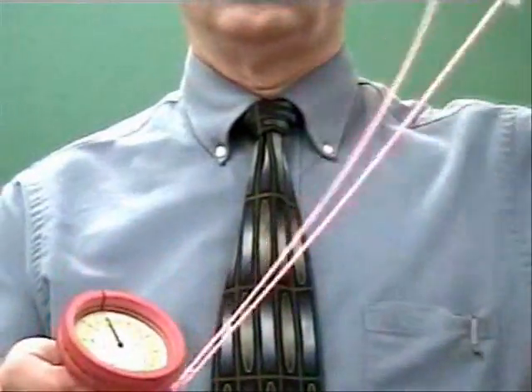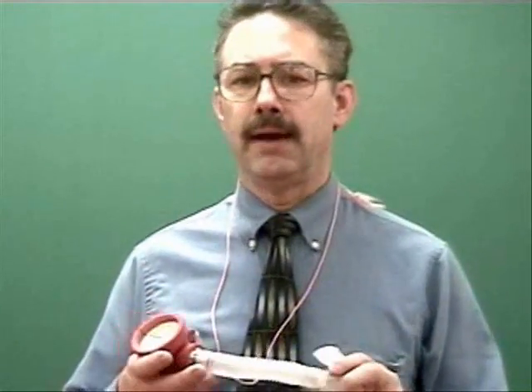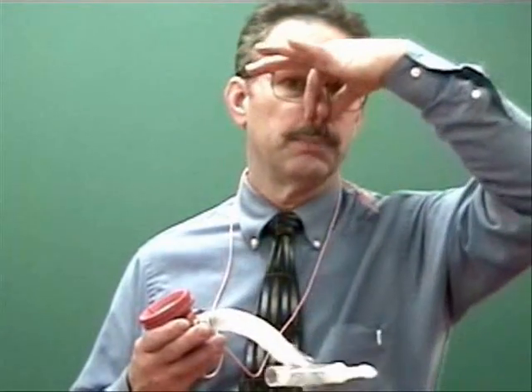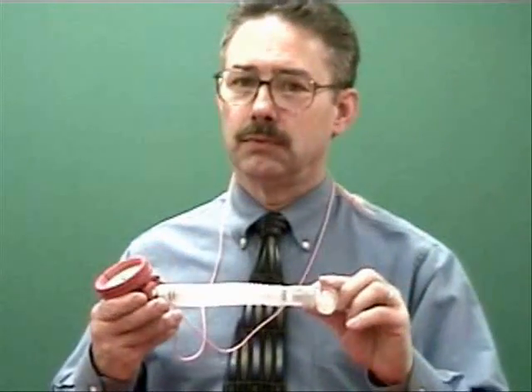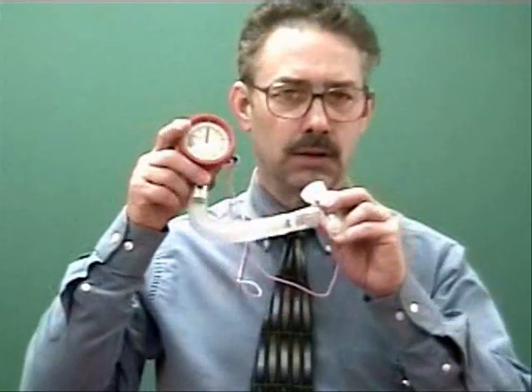So when we're doing a tidal volume and using a respirometer, you want to make sure you put the spirometer around your neck using the strap so that it doesn't fall and break. These are very sensitive pieces of equipment, so always use a neck strap to hold it from dropping to the floor. And simply have the patient put the mouthpiece in their mouth. If necessary, use nose clips to prevent them from inhaling from their nose, or simply use their own fingers to hold their nose. So, we're going to have the patient breathe spontaneously, normal, easy breathing, and watch the gauge.